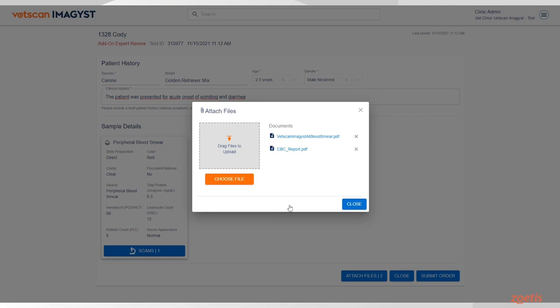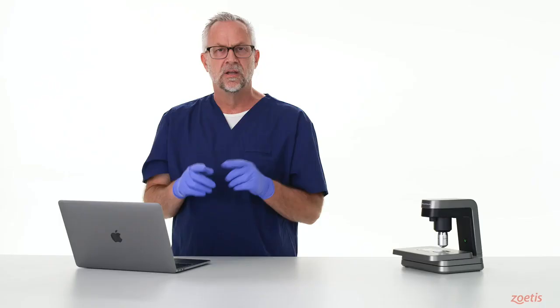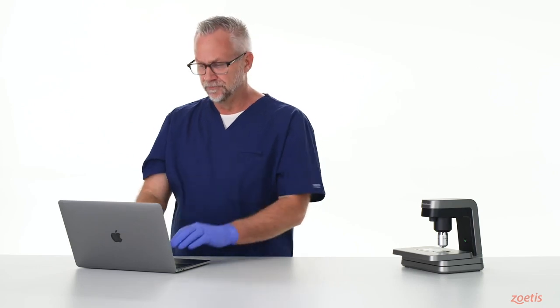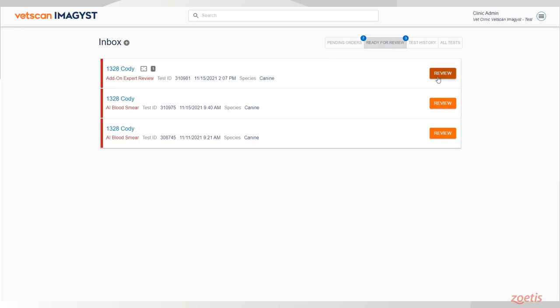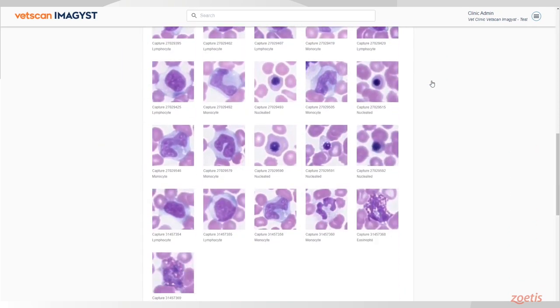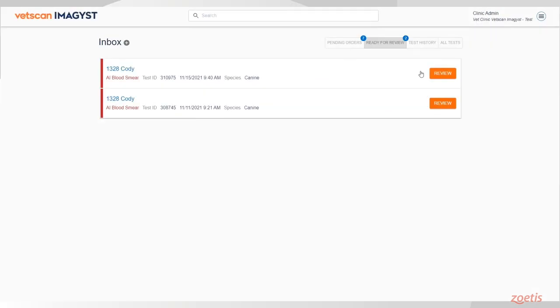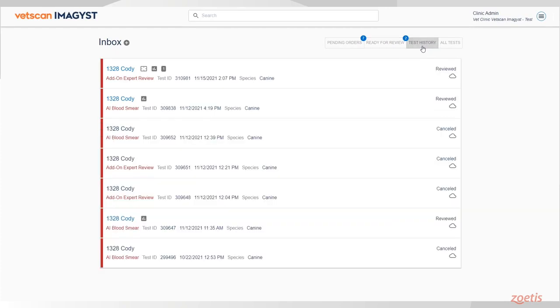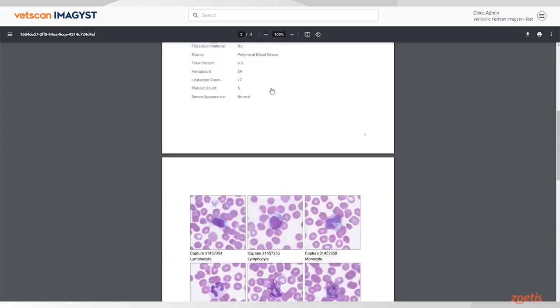When those files have been uploaded, click Close and click Submit Order. Your test has now been submitted, and the reports will be available in the Ready for Review section as soon as it is finished by the pathologist. After reviewing, select Acknowledge. The report is now available in FUSE and in your Practice Information Management System. You will also have access to a shareable PDF.